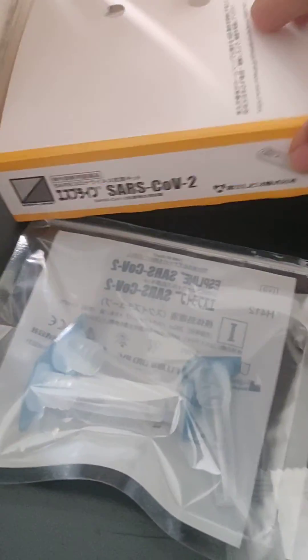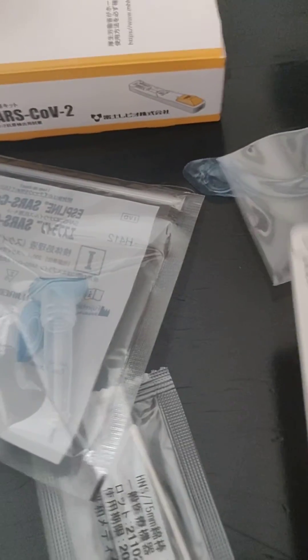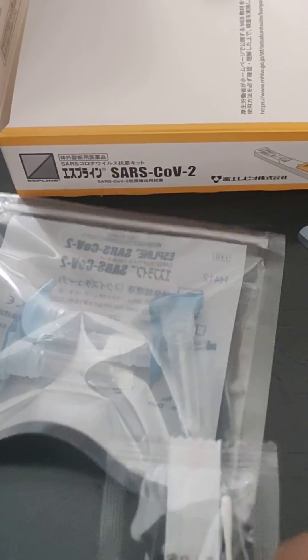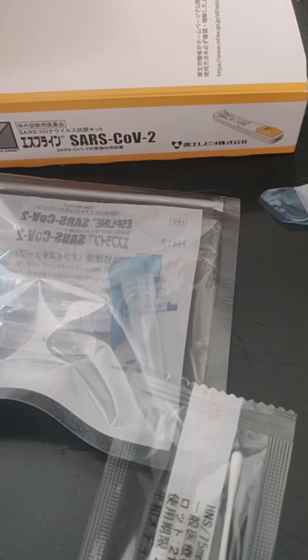Usually in this SARS-CoV-2 kit given by the Japanese government, we have two COVID testing meters, four capsules, and two nasal swab entities. So we have the chance to do it about two times, and we have to do it carefully.